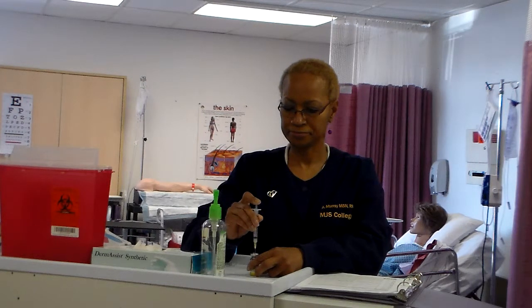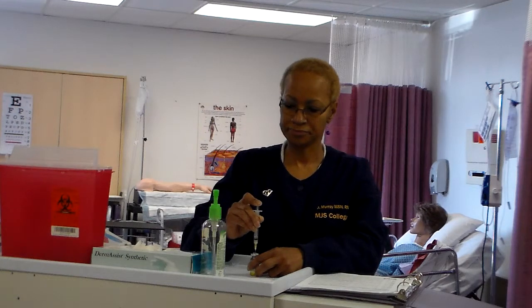Inject air into the vial's airspace, holding on to plunger. Hold plunger with firm pressure. Air pressure within the vial sometimes forces the plunger backward. Sometimes if there's too much air, maybe one of the nurses has been putting in 2 milliliters of air, but they only need to draw out 1 milliliter of medication, then you'll find that it's going to be hard to push this air in. So you only want to draw out the amount of air as the amount of medication that you're going to insert.